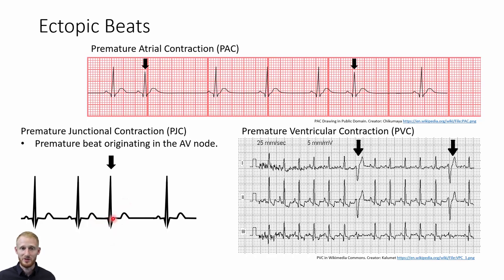is here, which means it's buried within the QRS complex, or sometimes it's right before the QRS complex and upside down, or right after the QRS complex and upside down. But that would be a PJC.